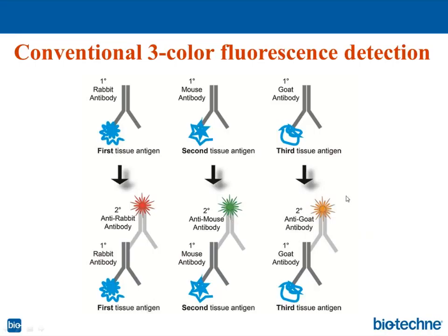So there's no expected cross interference or cross reaction of, for example, anti-goat secondary antibody with the mouse primary antibody, or anti-mouse antibody with goat. So we're doing good. So this is a very convenient and easy way to do multicolor fluorescence.